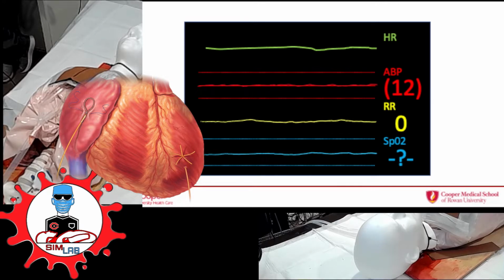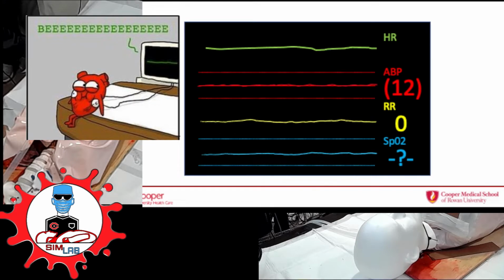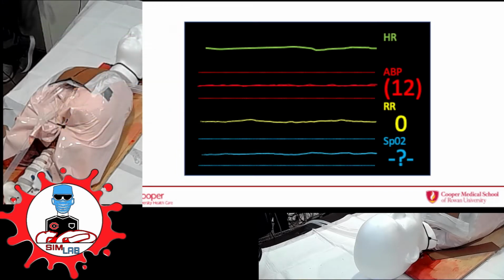Okay, so what's a rhythm that you see? Asystole. Asystole, okay. So patient's unresponsive. So what are you going to do? Try to pace. Try to pace? Yeah. Okay. Why is that? Like you wouldn't do that with anybody else.